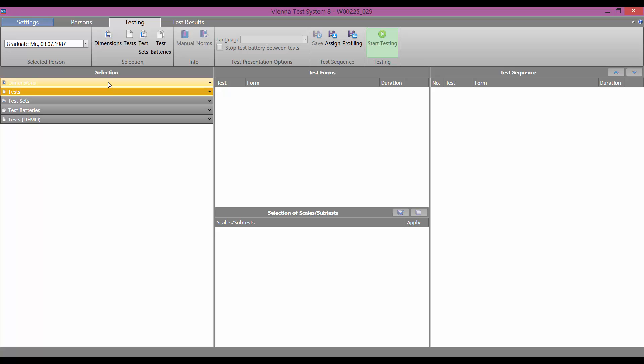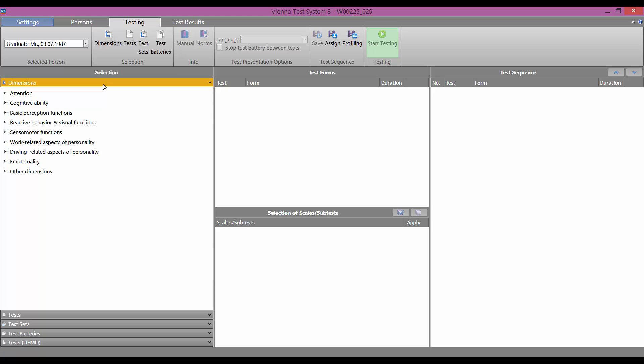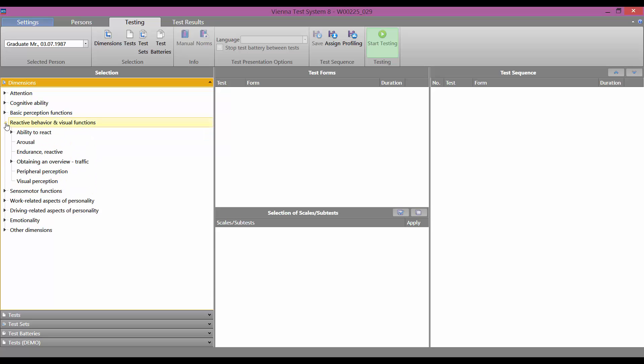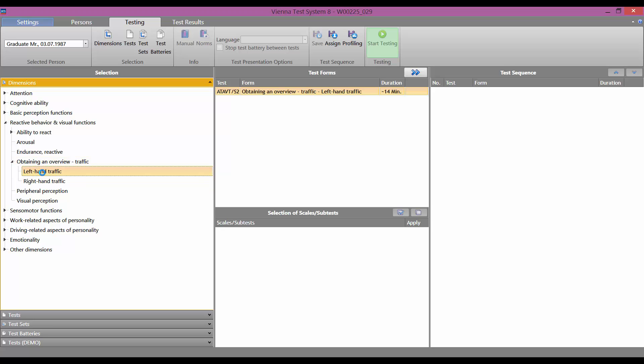In the column on the left, you have four different ways of selecting tests for presentation. The first option, by dimensions. You select the dimension that you want to test and the Vienna Test System suggests the appropriate test.